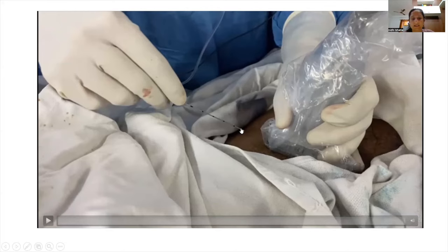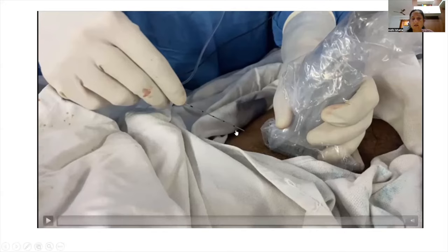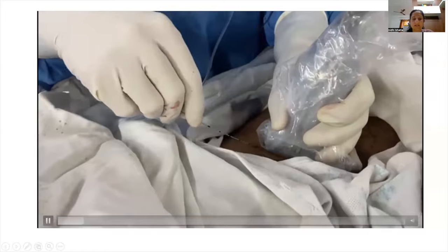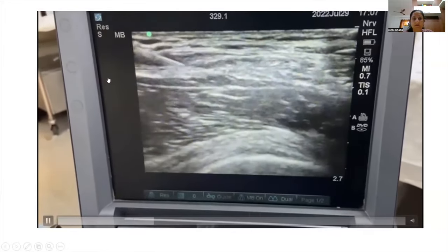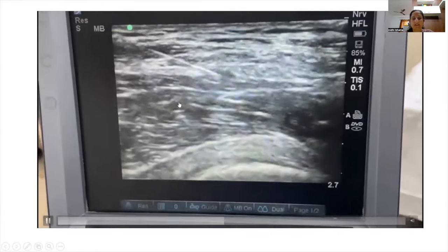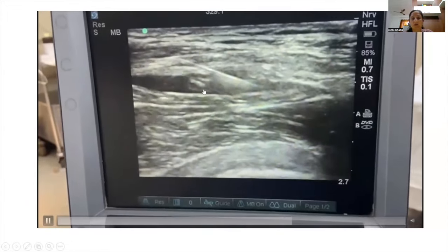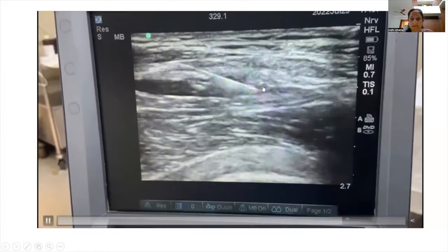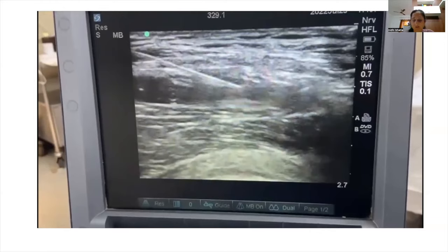For depositing the drug, ecogenic needles — generally 80 to 100 mm — are used. The needle is inserted in-plane from lateral to medial, allowing visualization of the entire needle course. The first pop felt is the fascia lata, and the second pop is the fascia iliaca. Once through the fascia iliaca, the local anesthetic is deposited with good medial to lateral spread. As a volume block, approximately 30 ml of 0.2% to 0.25% ropivacaine is used.